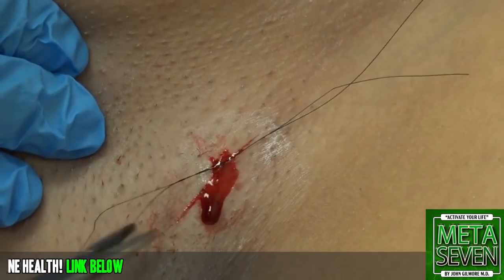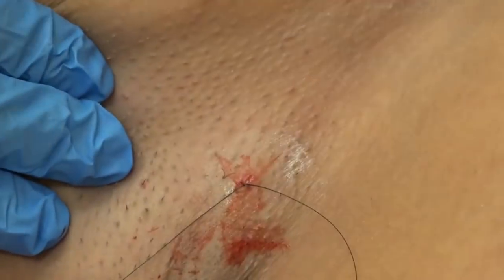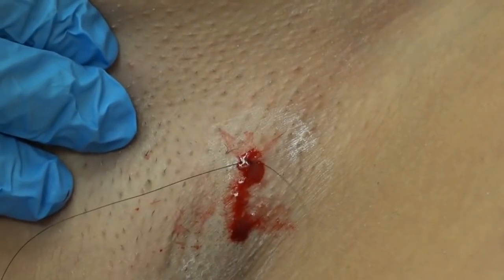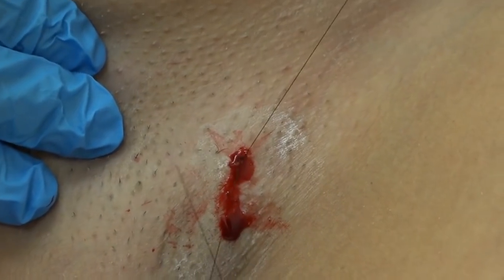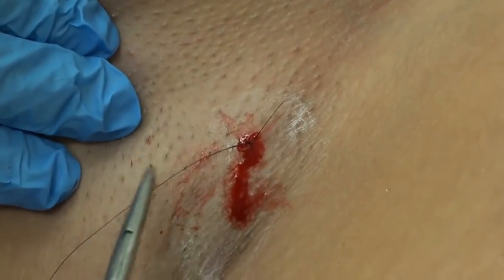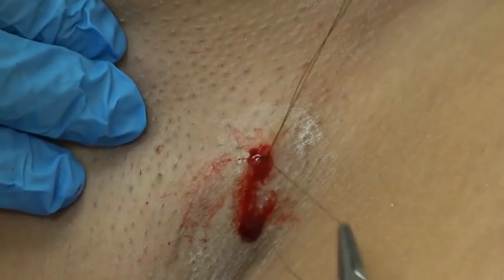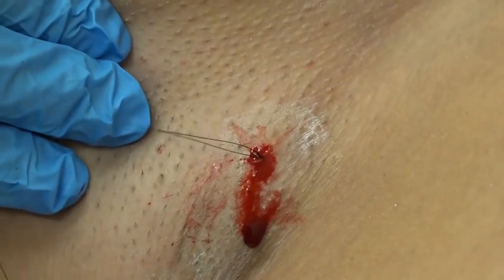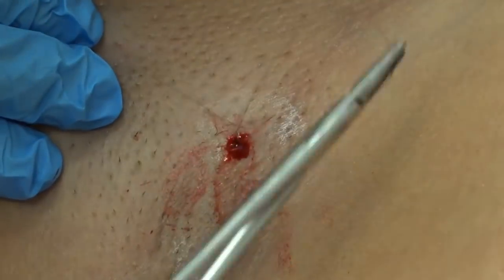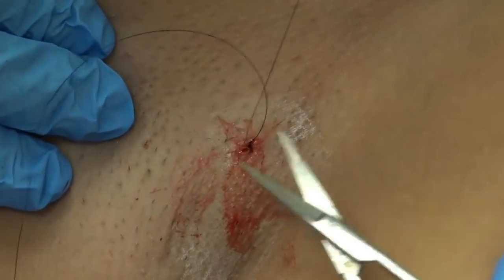There you go. Just do two loops - loopity loop twice. And then like this. That's pretty good. Grab it and pull it through. Don't stick Scarlet in the eye with the needle. Do a little dab on that. Let's see how you did. That's not bad. Make it a little bit tighter. Do just a single loop. Did you get it? No. You want me to do it? Yes. Okay, because you were doing a good job. It didn't tie up.